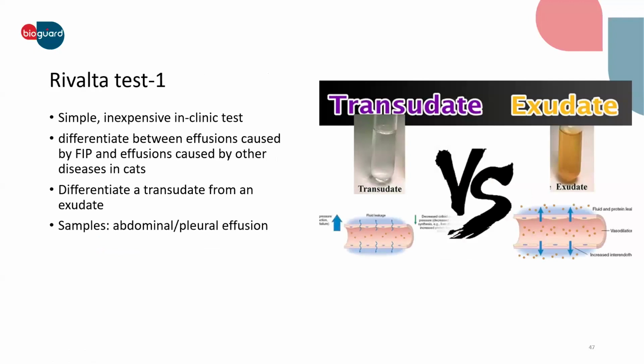Another commonly used test in clinic is the Rivalta test. It's simple and inexpensive.